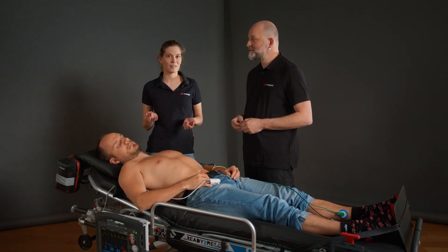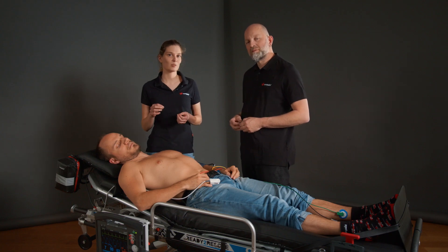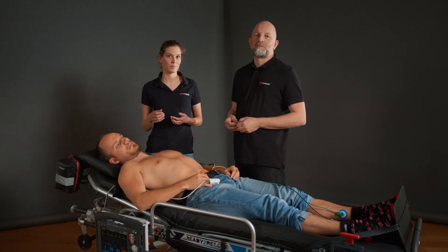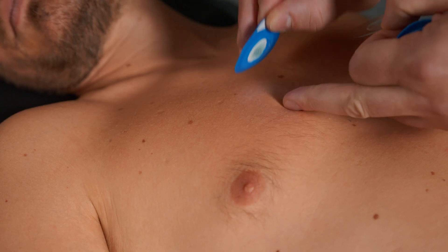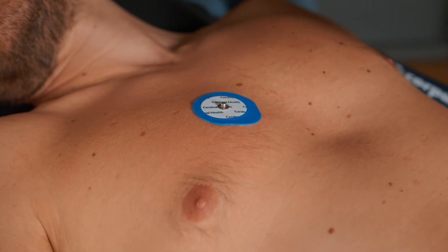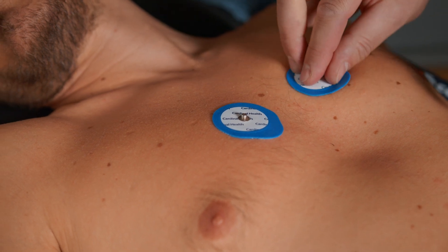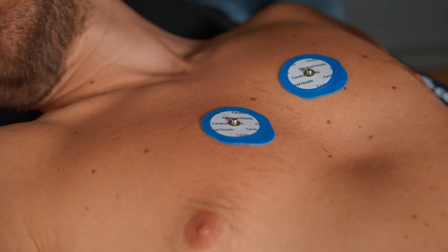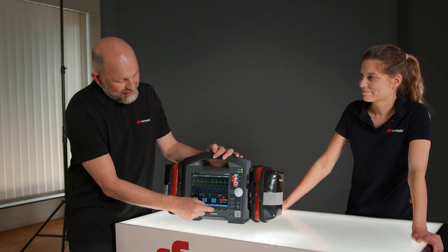To ensure reproducibility of the ECG, it is important to make sure that the chest wall lead electrodes are correctly positioned — not directly on the bone but on the intercostal spaces. If you use ECG max, you should pay particular attention to correctly positioning the electrode for V2. To start recording the diagnostic ECG, press the DECG button.